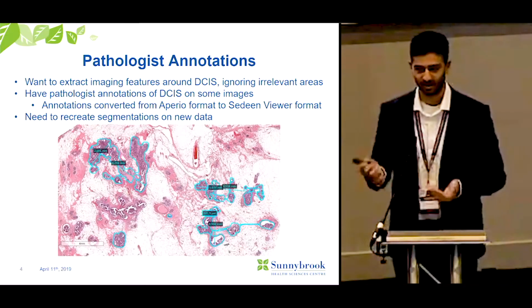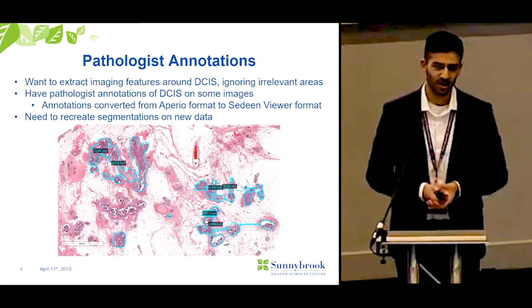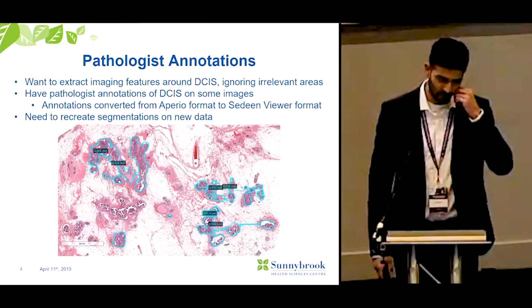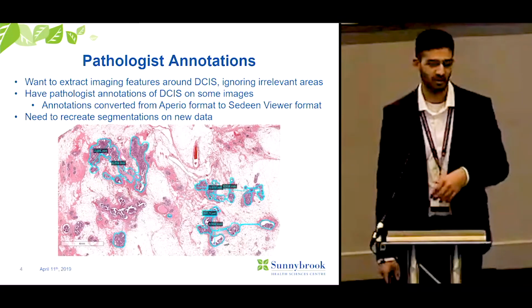We want to be able, as Andrew mentioned, to extract imaging features from these DCIS regions and ignore the irrelevant areas around them. So we have pathologist annotations on DCIS images, and these annotations were converted from the Aperio format to our new Sedin format.